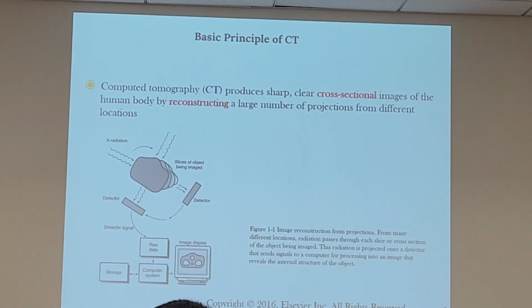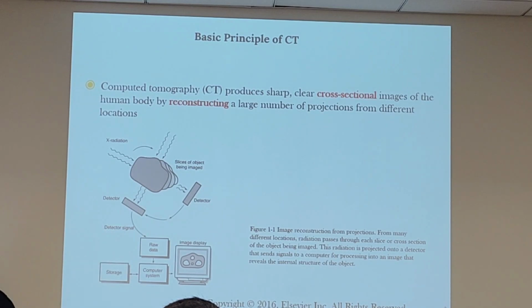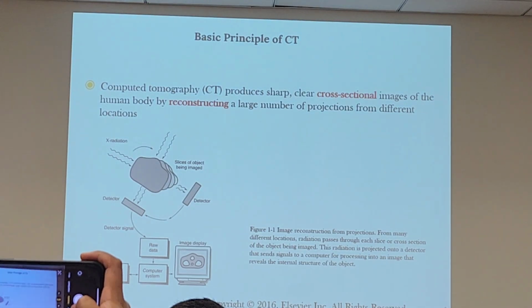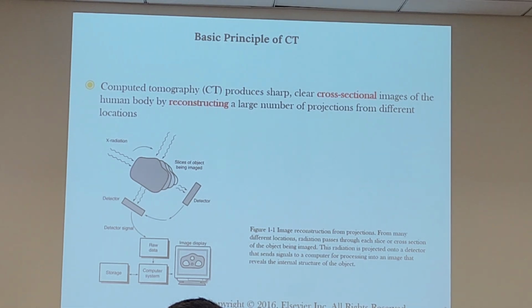Okay. So what is the basic principle? We have a piece of equipment, we have math, right? We have tomography as a concept, aligning the x-ray tube with the imaging plate, moving from side to side, right? Now we're incorporating math and algorithms to reconstruct the image. So what are the capabilities now? Moving forward, we're now able to take images, acquire data, and then go back and manipulate them.